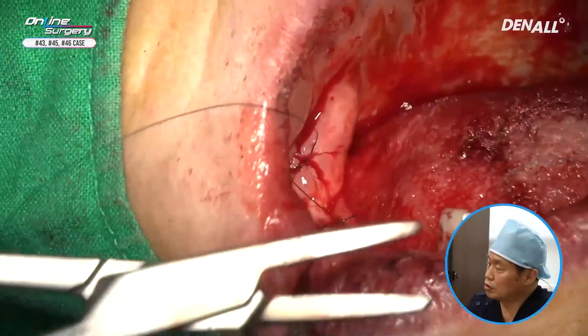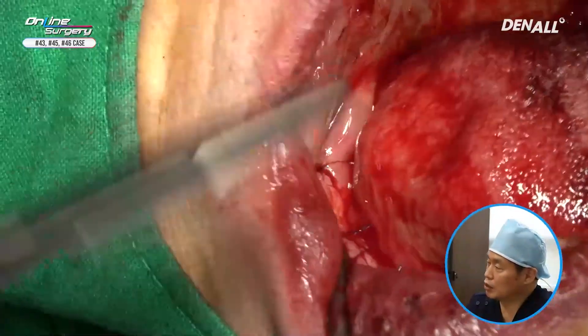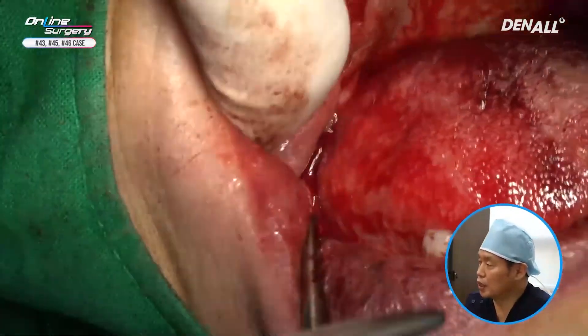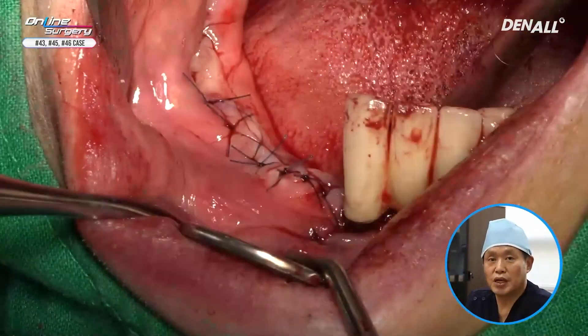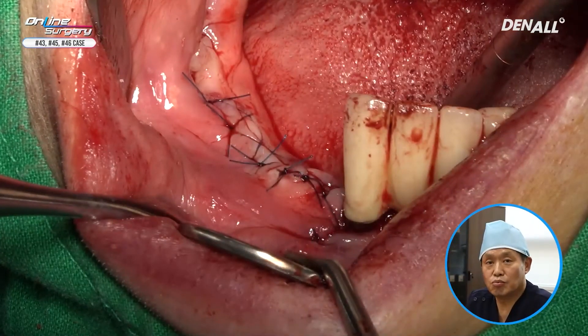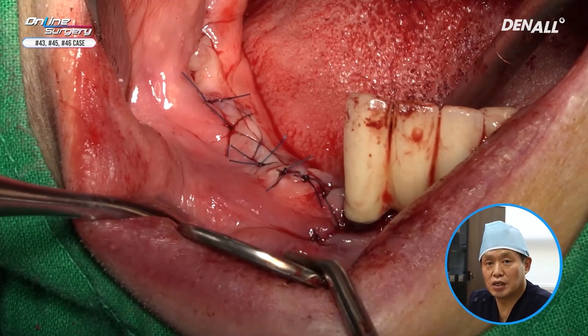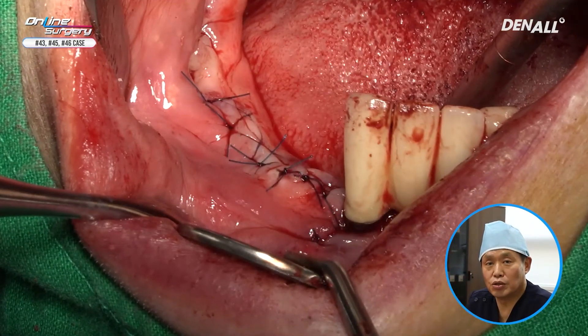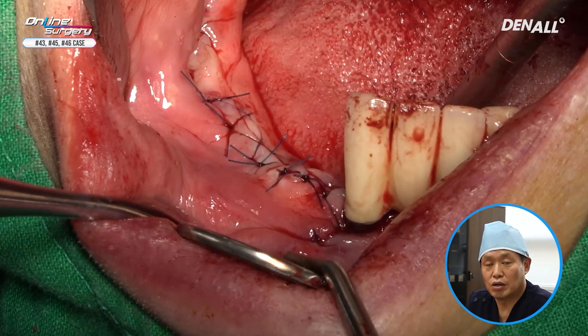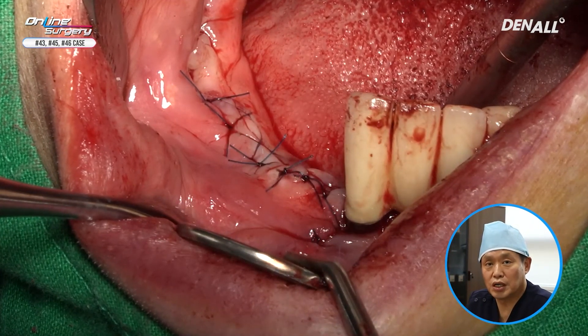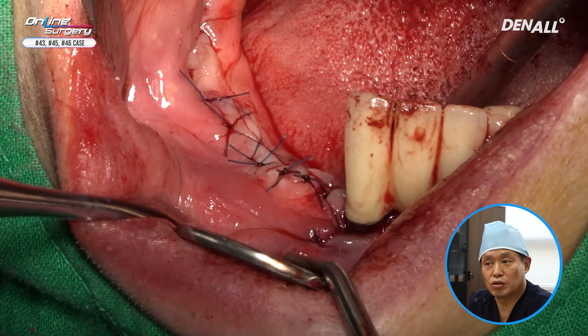The surgery is now complete. As you can see on the canine, I used OsBuilder to do GBR and did augmentation. Surgery is now complete.